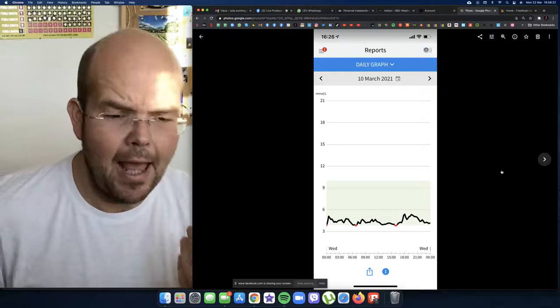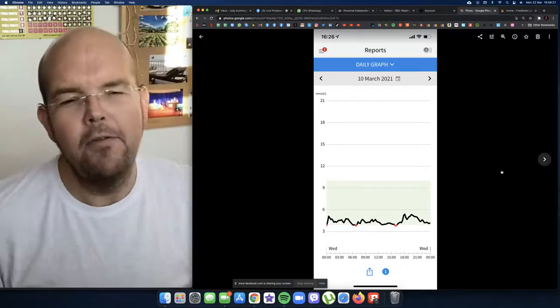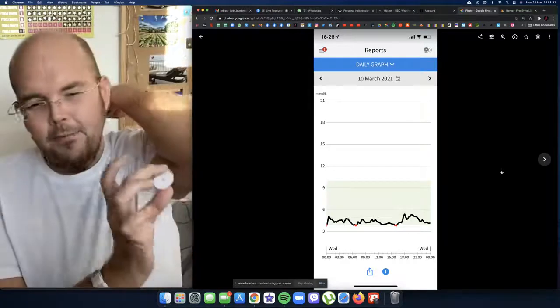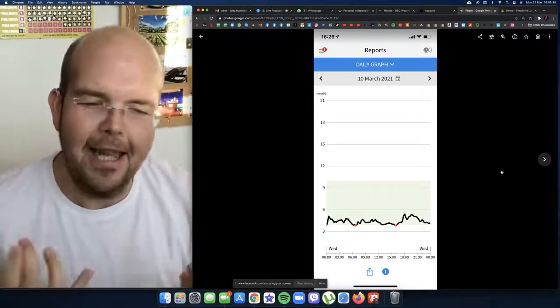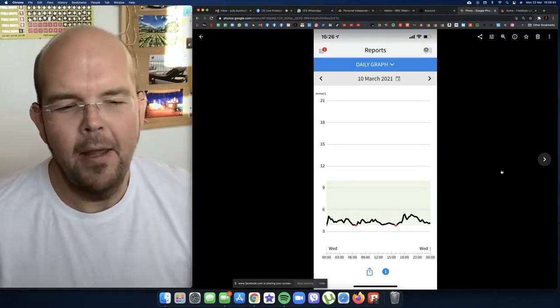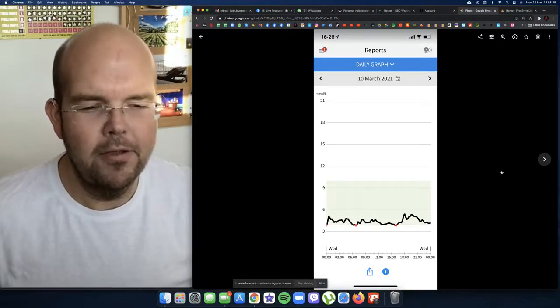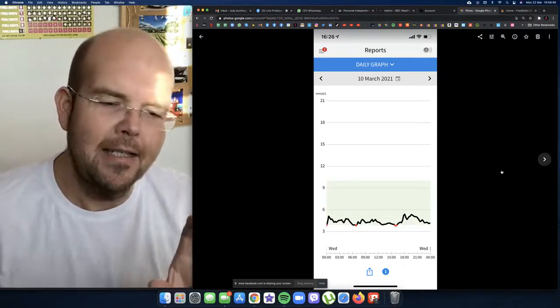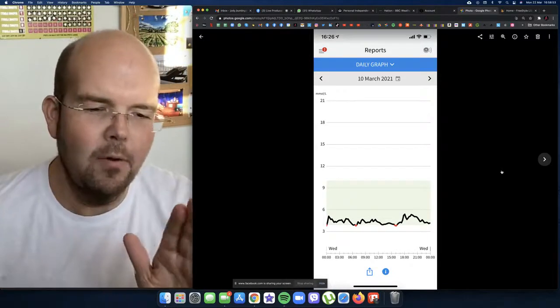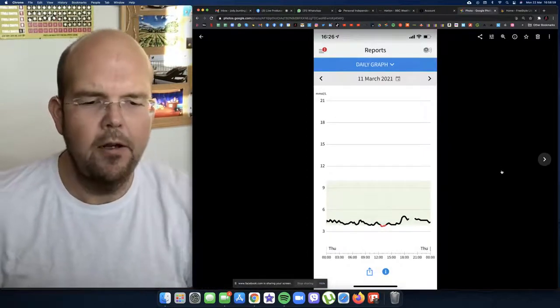Moving through the day it didn't really jump up when I ate. In the afternoon I had a little bit of a lull — if you're the sort of person that needs an afternoon nap, with one of these devices you can physically see that your blood sugar is going low and this is why you need that nap. I then ate something because I scanned and saw my blood sugar was low, and it went back up and slowly came back down.